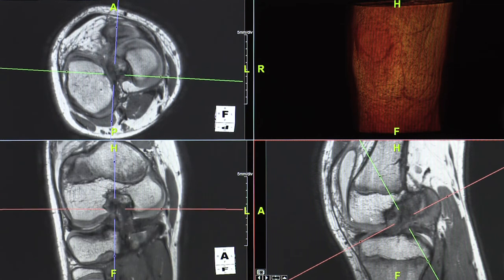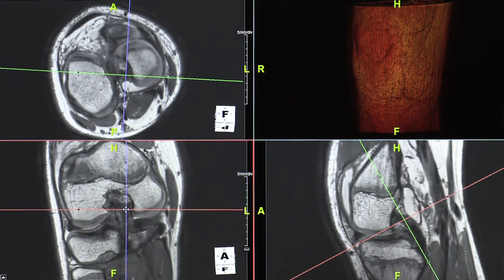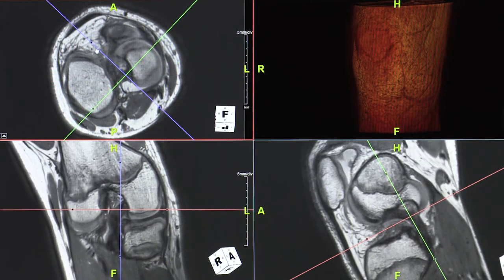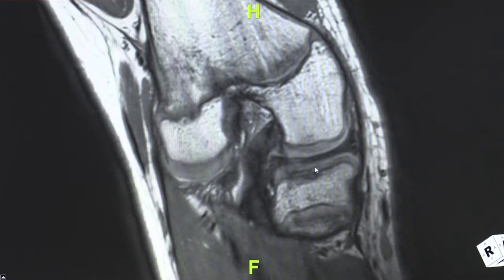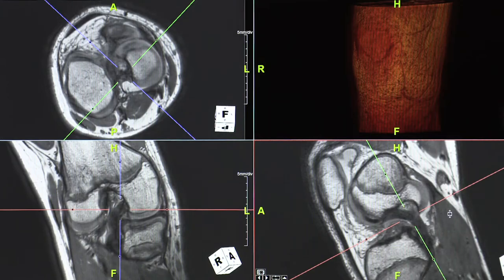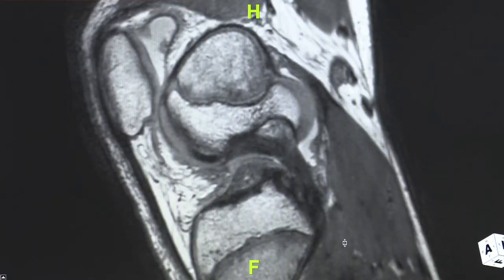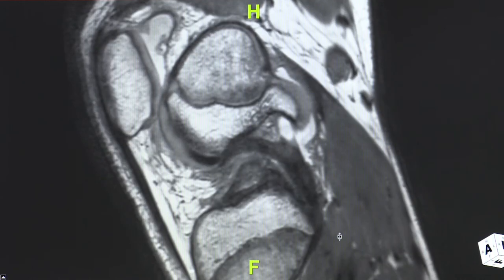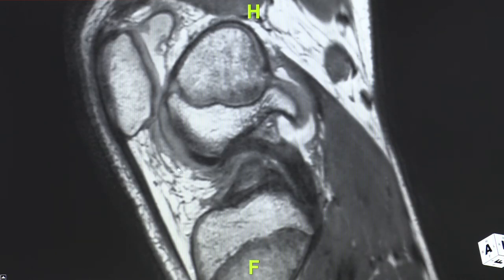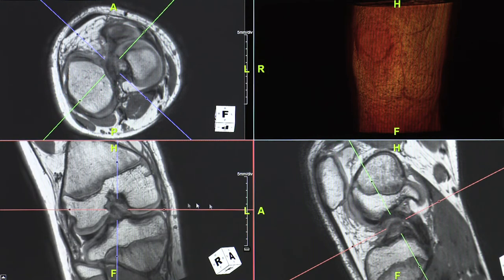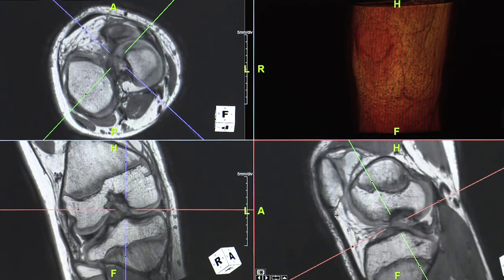To get the PCL, you do the same thing — outline along the PCL and bring it here. You can rotate any way you want and outline to see the PCL in two directions: here is the PCL going top to down, and here going from femur to tibia. If there is a tear you will see the break in continuity. Again, this is non-fat-sat; ideally you want fat-sat to see tears better, as shown in the presentation.